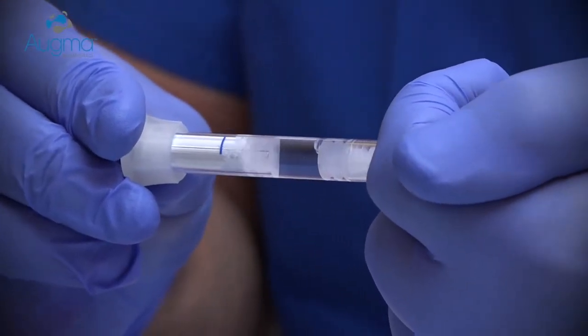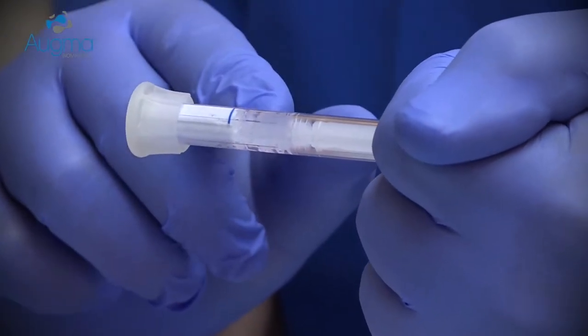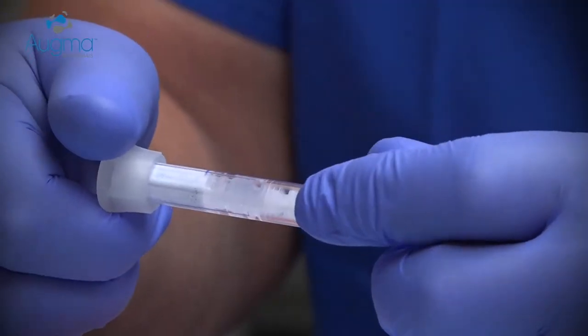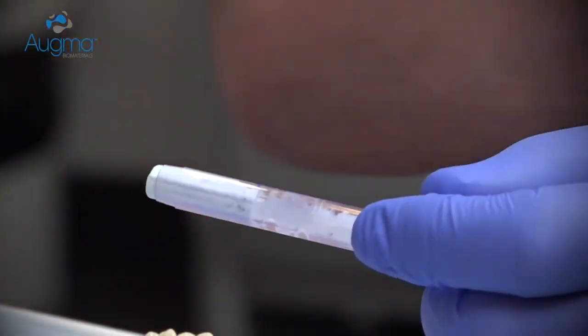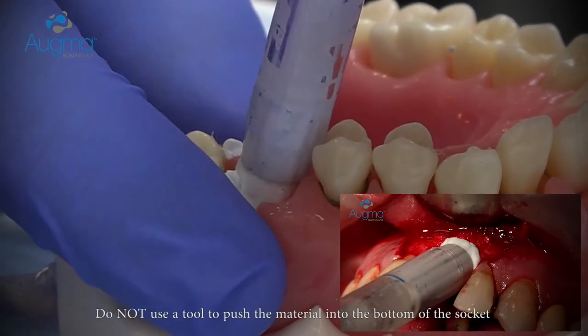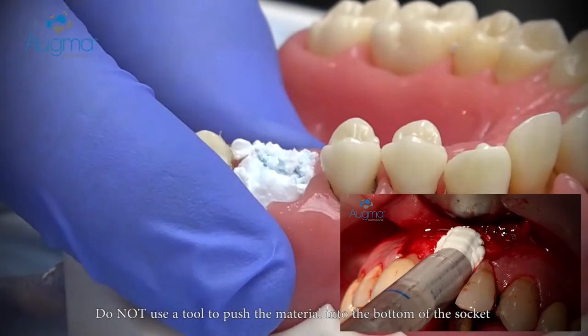Press the shaft against the palm of your hand until the first piston reaches the blue line. Now the material is already activated. Remove the syringe head and approach to the socket side and eject the material into the socket.